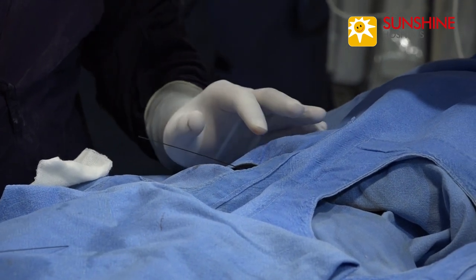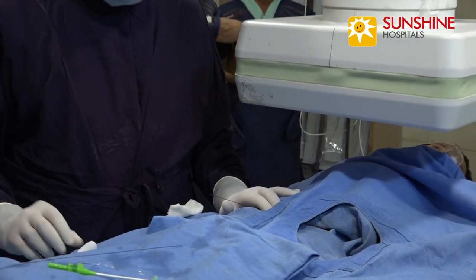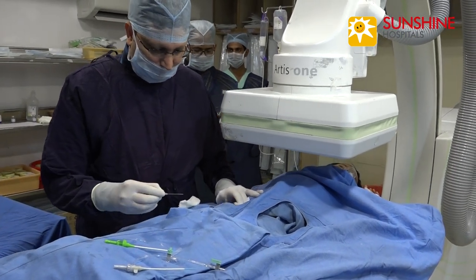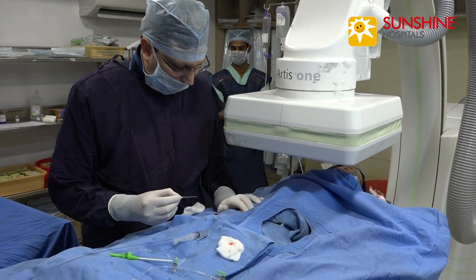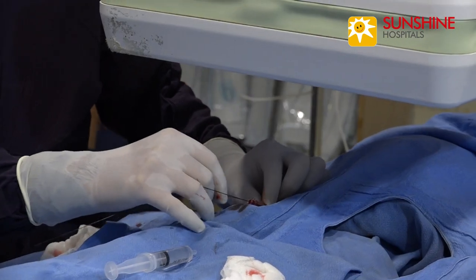a non-surgical method, that is called device closure for PDA. Surgery, especially in females, requires a large posterolateral incision. To avoid that, we have decided to do a percutaneous closure of the PDA.